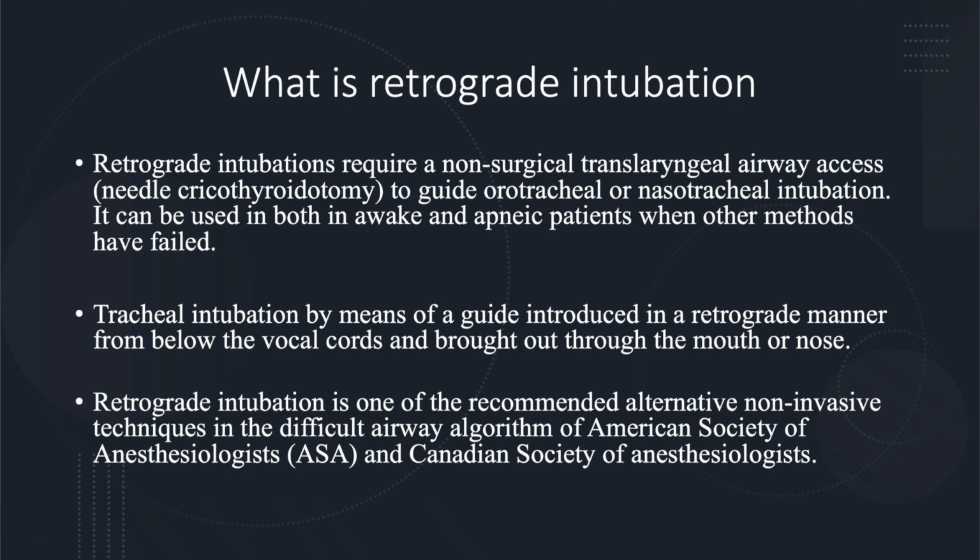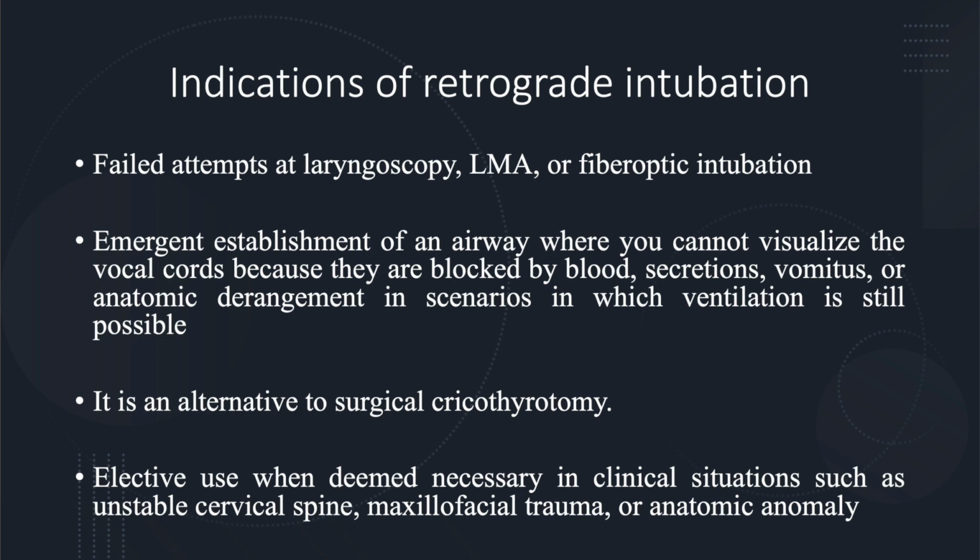What are the indications of retrograde intubation?